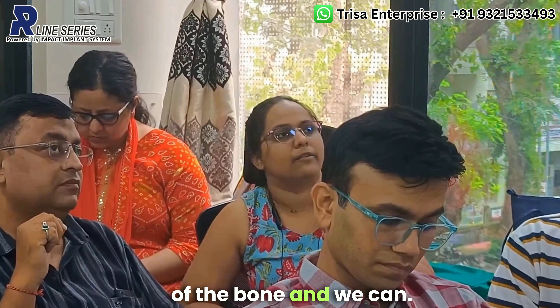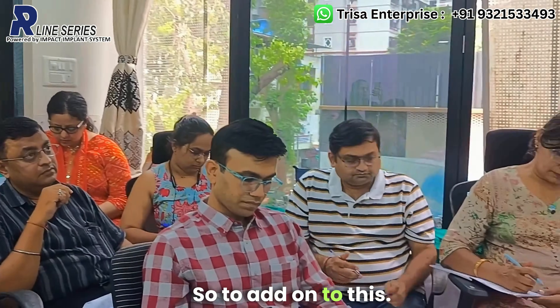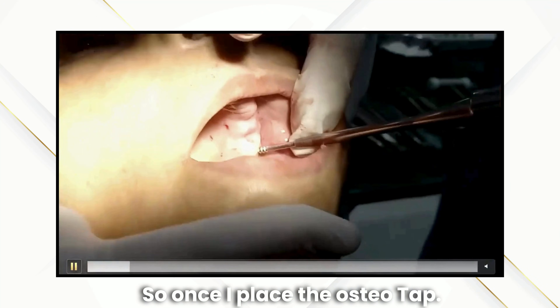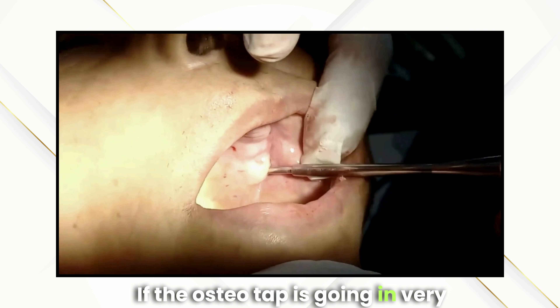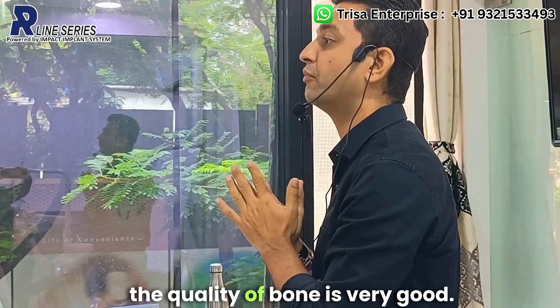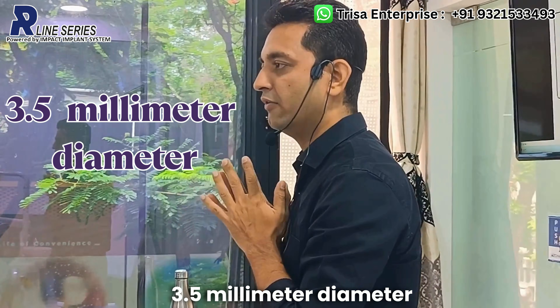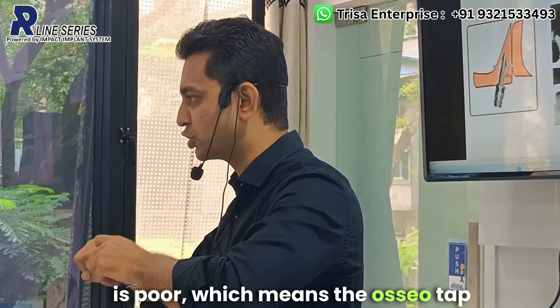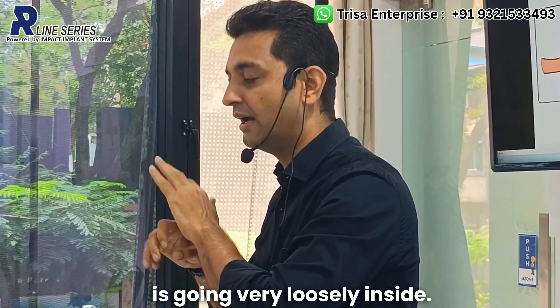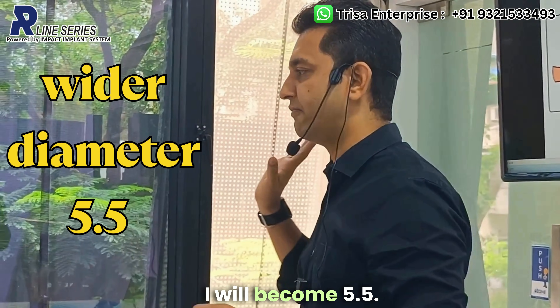The next step is the osteotap — to assess the quality of bone and judge the torque. If the osteotap goes in very tight, bone quality is very good and you will likely need a 3.5 mm diameter from the Impact R-Line series. If bone quality is poor and the osteotap goes in very loosely, you may need a wider diameter of 5.5 mm. When in doubt, select the wider diameter.